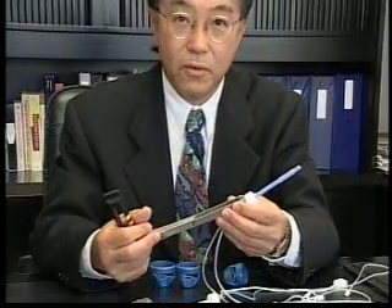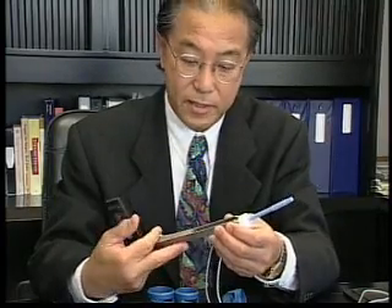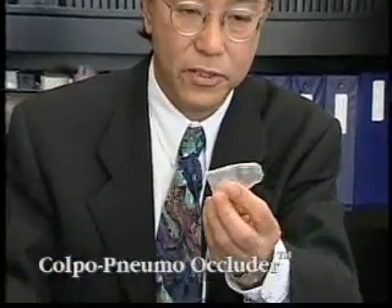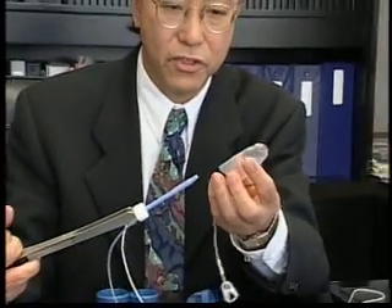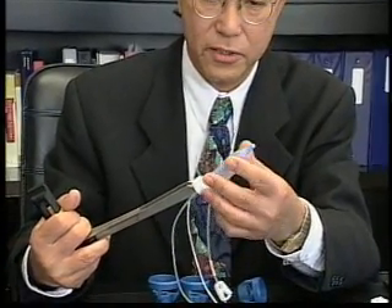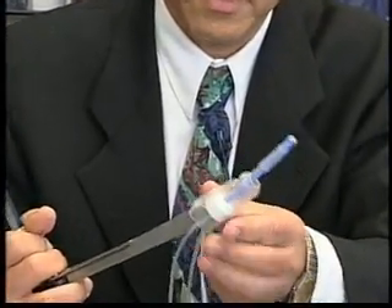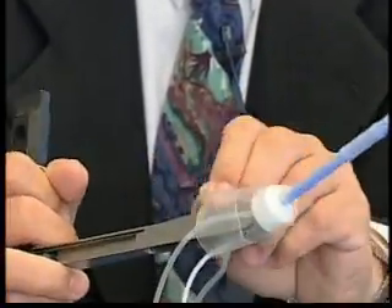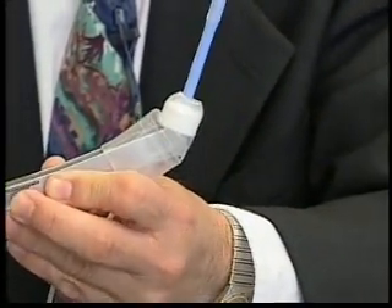What we did was to add onto this existing system attachments for simplifying total laparoscopic hysterectomy. This is the pneumo occluder, which occludes the vagina to prevent gas loss. It is inserted over the tip and does not hamper activity in any way.